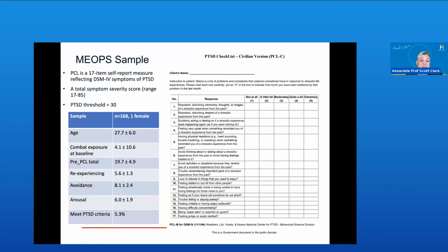And so we can see that in this sample, we were able to get baseline EEG before people were deployed into combat. So these people had differing amounts of previous trauma, but at baseline the study measured those features. And this data was originally collected by Sandy McFarlane and the Centre for Trauma Studies at University of Adelaide.